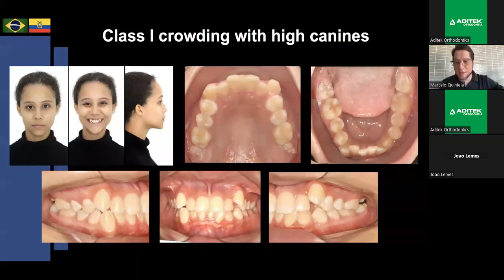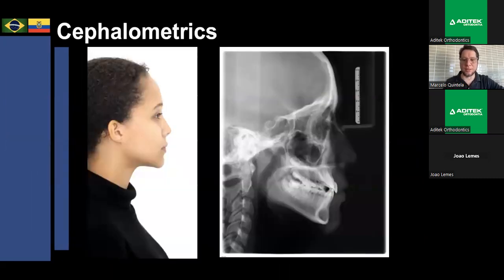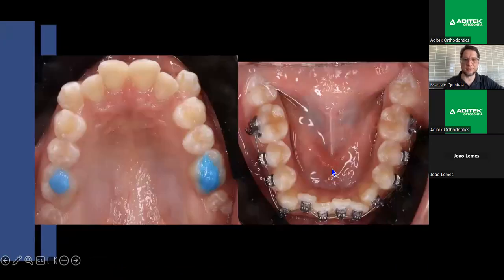It's by another student, the same class 1 crowding with high canines, a Brazilian girl, and they put the Moderna Orto protocols. Look, she is at the limit of angulation and torque in the incisors. But you don't do extraction. You put a build-up and archwire with level force for 8 to 10 weeks.